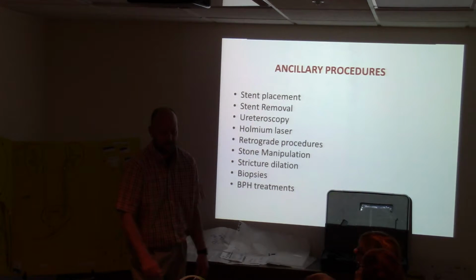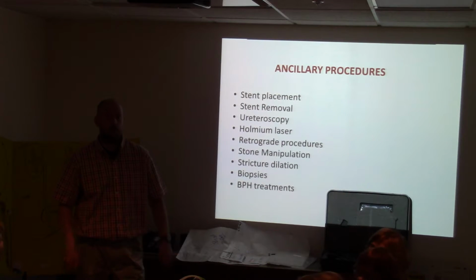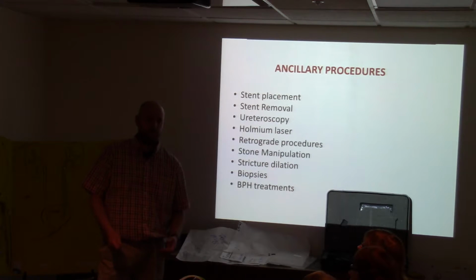A retrograde would be a catheter because you're going back up. When you're injecting through a stent, you're injecting it into the kidney and it's coming down. So, coding wise, it's really not a retrograde. A retrograde is with a catheter going against the flow. So it's a different type of contrast? It's the same contrast. But a retrograde means going opposite of the way the normal flow is. So it would be a catheter that they would use to do a retrograde, going up.